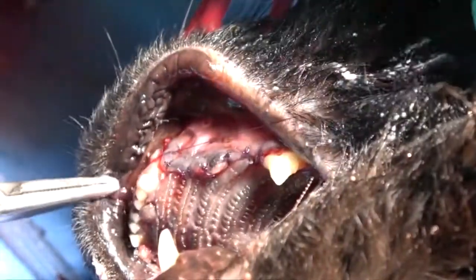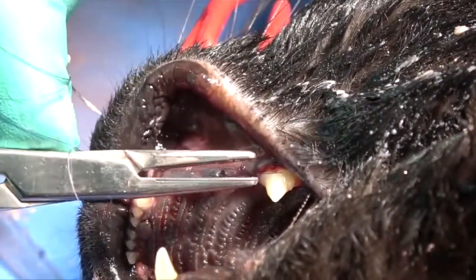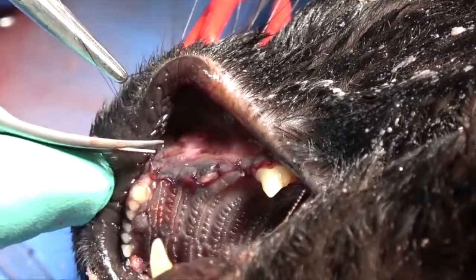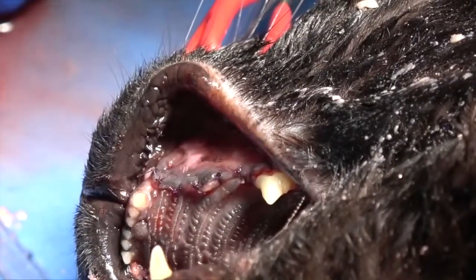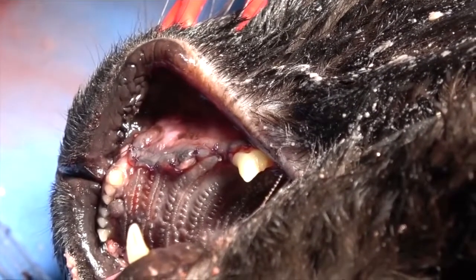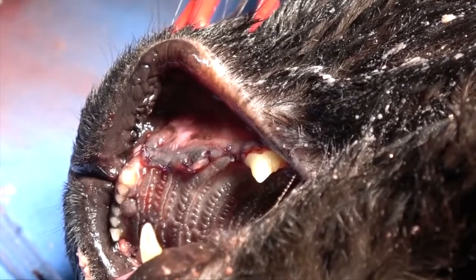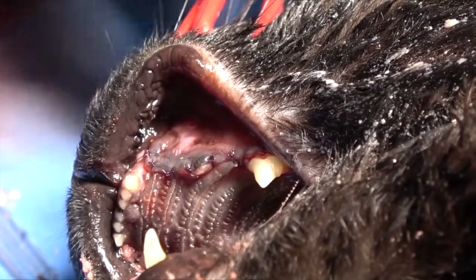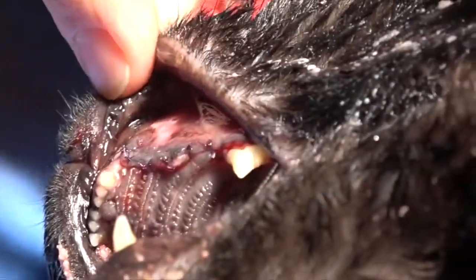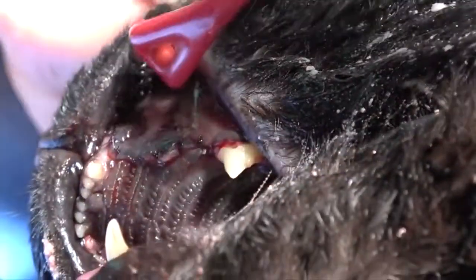Simple interrupted here. A common question is: do we have to refresh that edge before we close adjacent to the canine tooth? The answer is no, unless it's inflamed. If it's inflamed, what we generally do is incise that away at our initial incision, so we've got a clean attached gingival margin — or in some cases we even go up into the unattached gingiva, which is demonstrated specifically in the quadrant section in module 6.